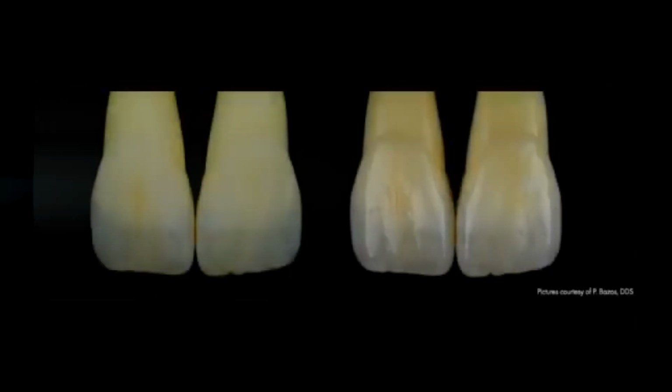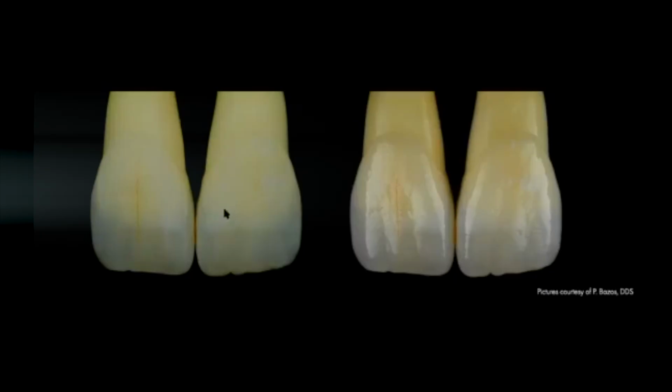So now if we have a look at this tooth from Pana's article, we can see that the layering is going to be quite different from what we've been used to. Normally, we do the layering technique starting from the cervical towards the incisal, and we start with more chromatic colors in the depth, inside here in the cervical, and as we go to the incisal, we use more whitish colors, more bright colors.